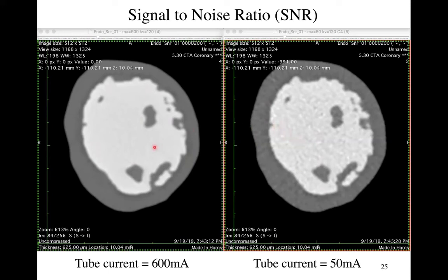Well, when I go to the high signal to noise, I realize it is not. It's just a random dark signal here. However, if all I want to do is tell you the volume of this left ventricle, this image is just fine. So it is task dependent. And we'll come back to this concept again: what your signal to noise has to be, what your spatial resolution has to be, is task dependent. Okay.